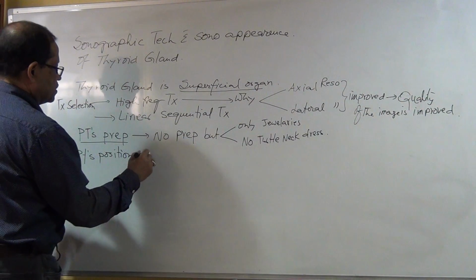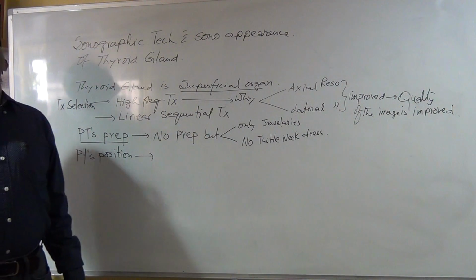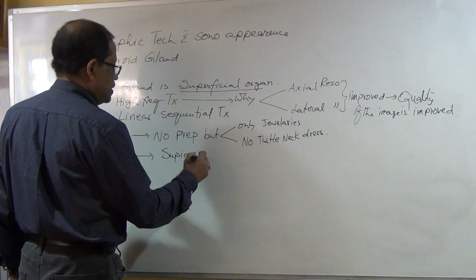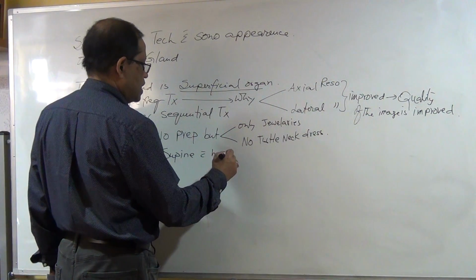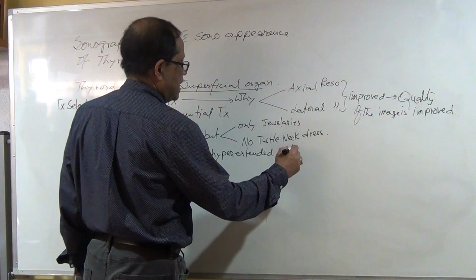Patient's position. What would be the patient's position? Supine with hyperextended neck. Why? Supine with hyperextended neck.